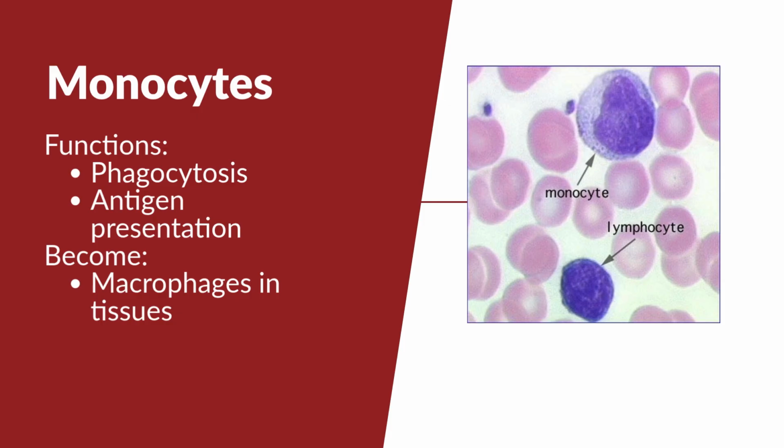This is how you would know the difference: a small lymphocyte versus the largest white blood cell in our system, which would be this. You cannot confuse this with a blast. There's no way. Do you see a nucleolus? No, you don't. It's not dark blue. It's not giving all of that chromatin. There's no possible way this could be one. You would probably be like, oh, this is a very large cell, it must be a promyelocyte. No, it ain't going to be that, because I got another slide for you and I'm going to show you why. Usually a myeloblast is going to look like Giardia missing an eye. Do you see an eye?